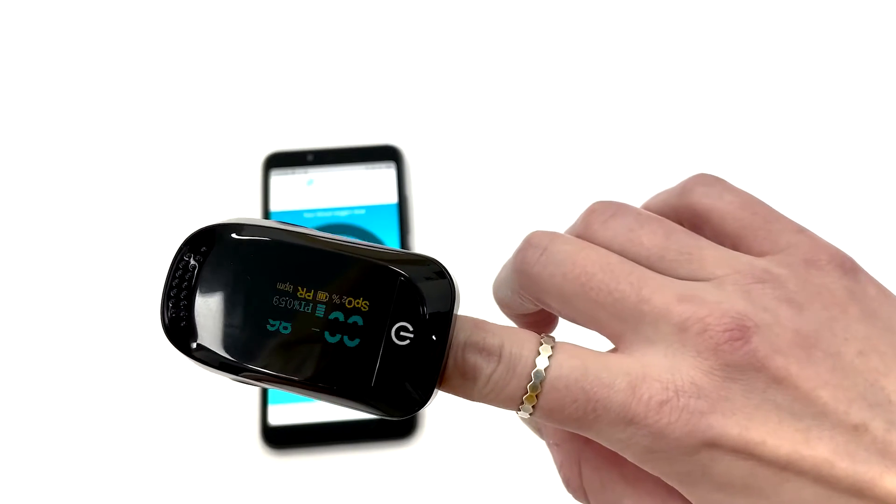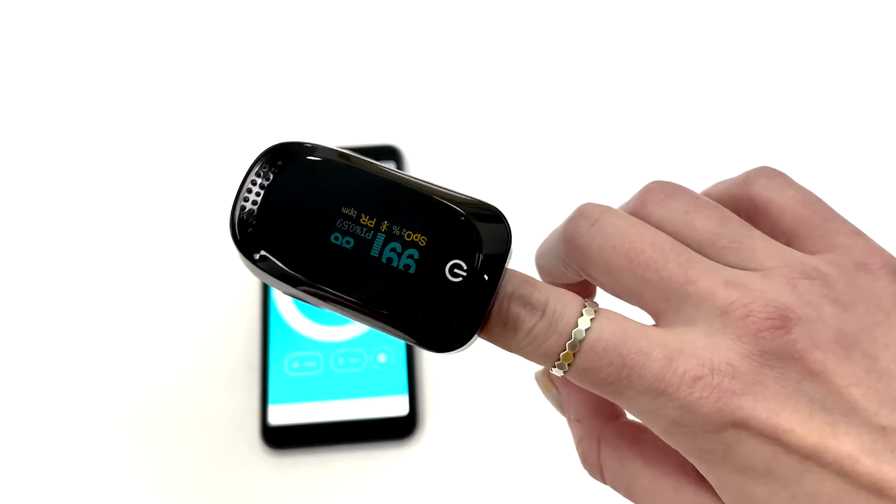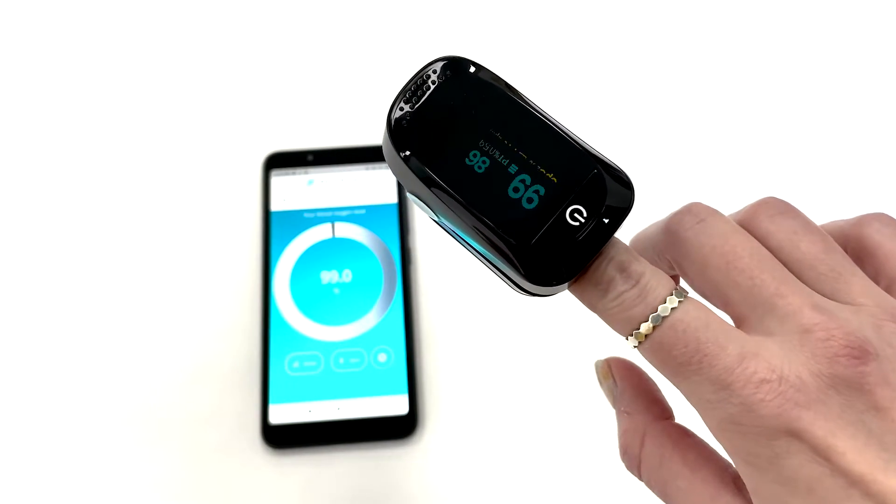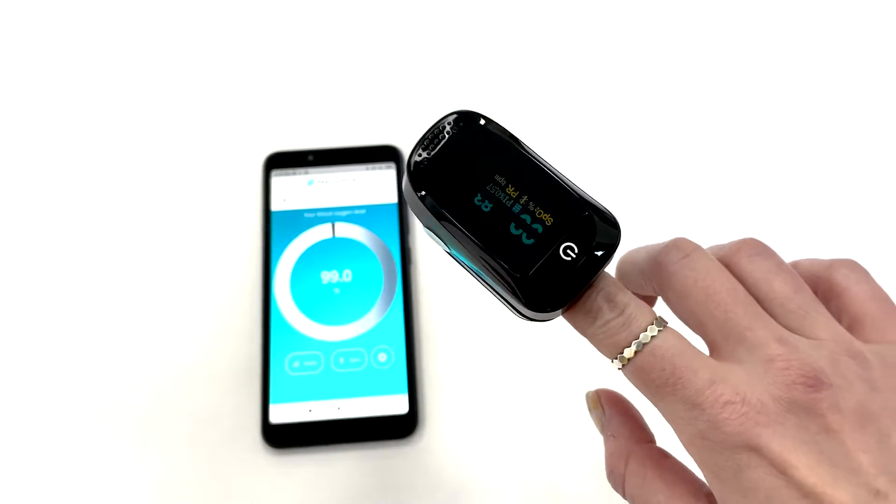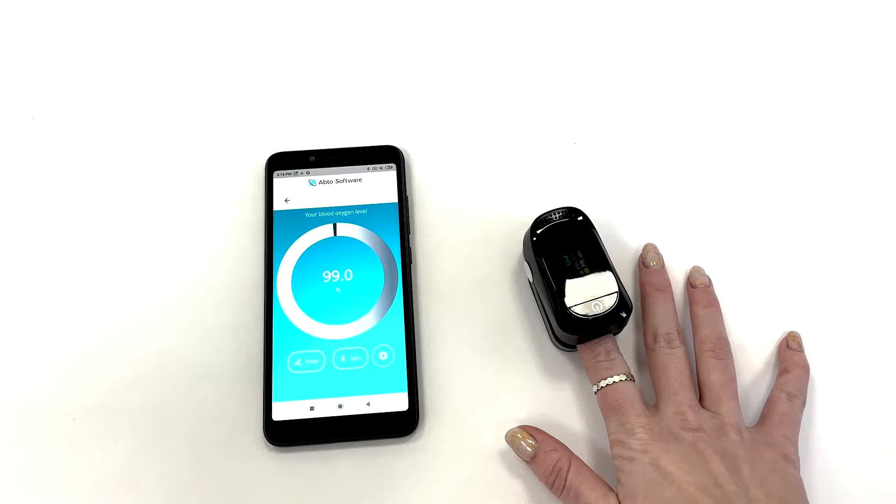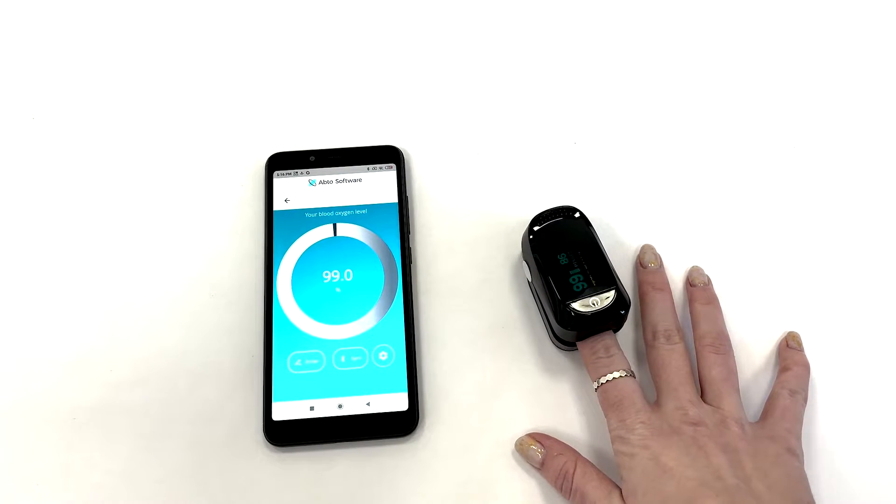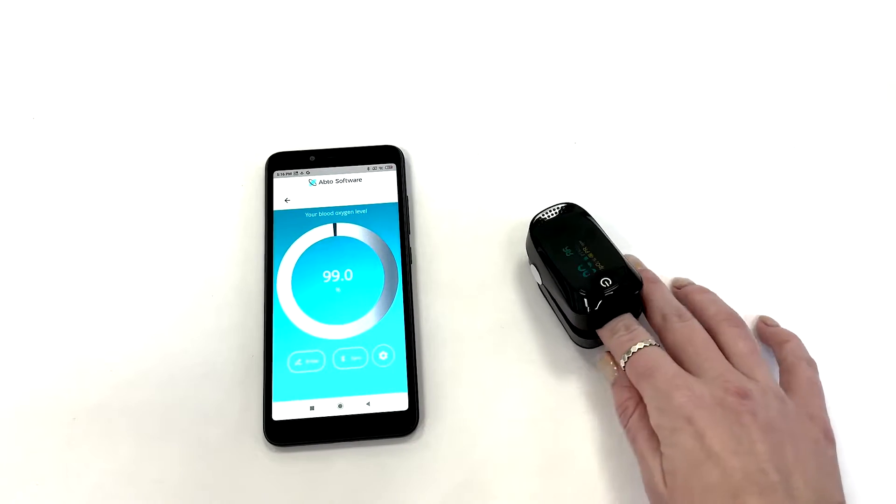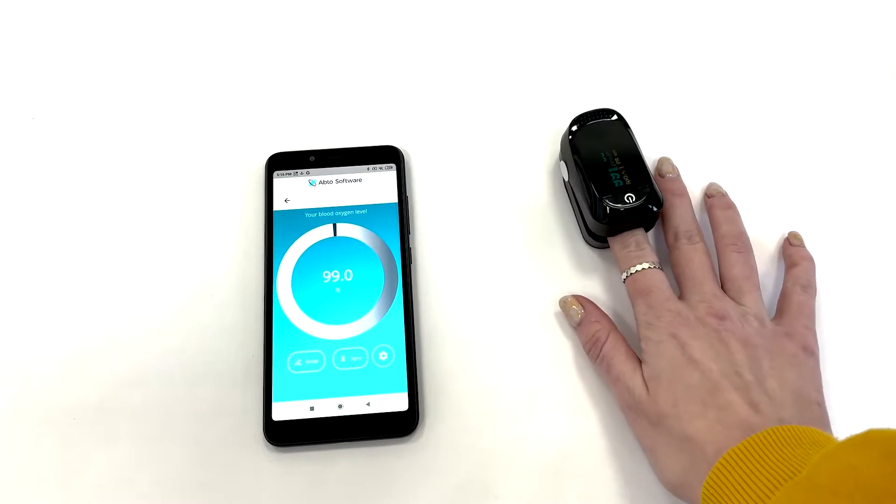As you can see, there is a choice between previously paired devices and all other available devices. After synchronization, choose the medical device being used.